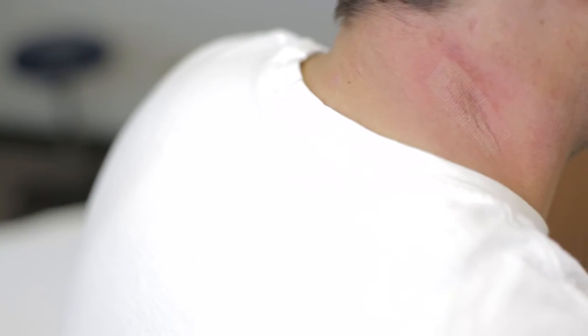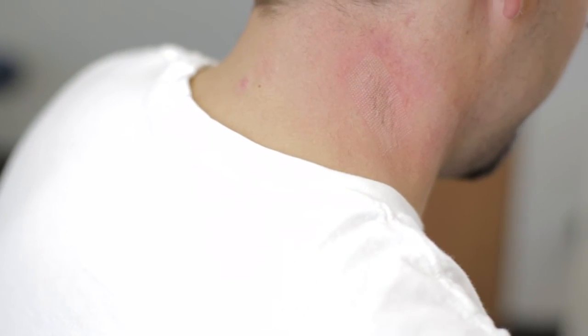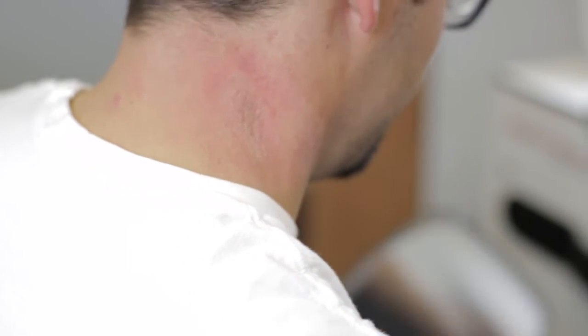We're done with the treatment. For aftercare, how it's going to feel on your skin — it's going to feel like a mild sunburn for probably the rest of the day, and then it should get better. If it's uncomfortable, you can take some Tylenol or Ibuprofen for any discomfort, and that should be all that you need.